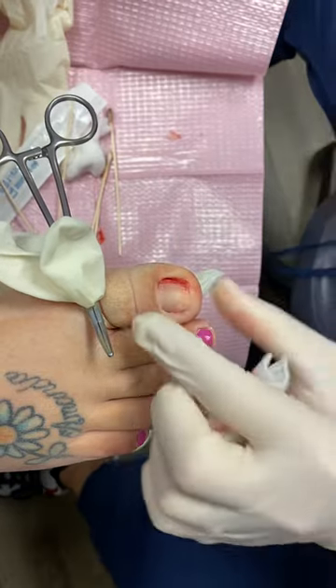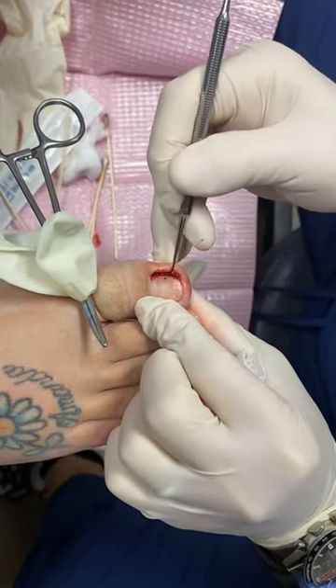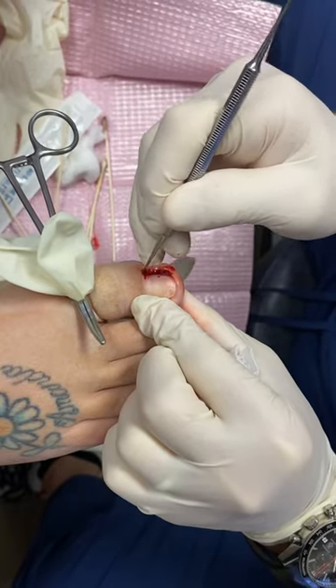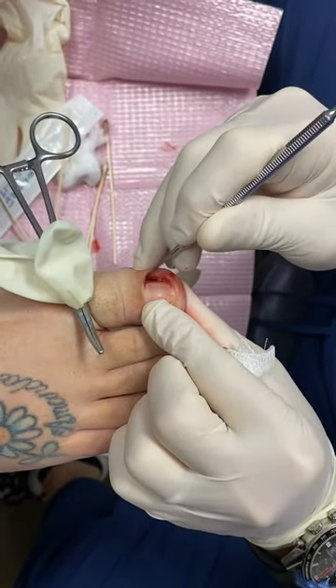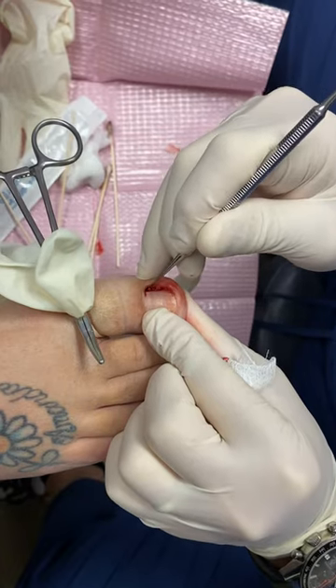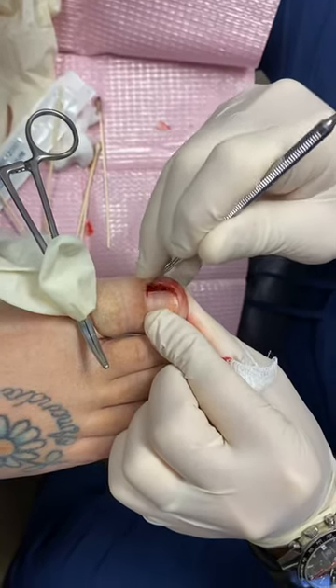We're going to take a little curetting instrument and curette this area underneath to make sure we didn't leave any debris back there. As we scrape this, you can hear a little scraping. Sometimes the patient will feel like something's scratching on their toe. What I'm doing is scraping those nail cells away.